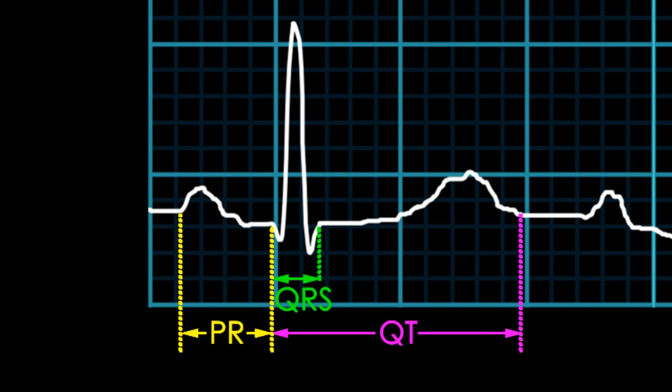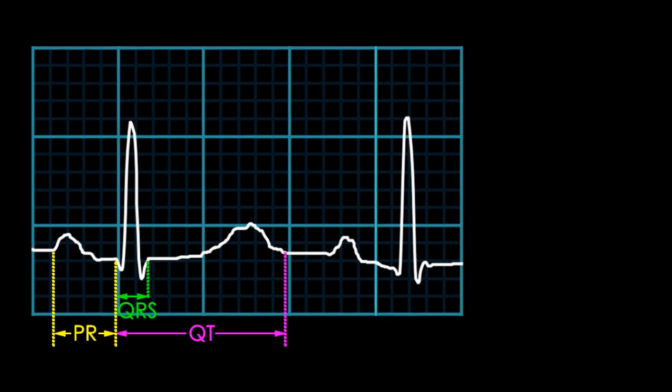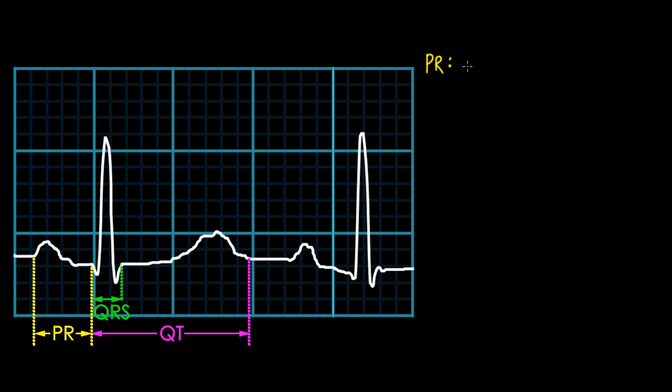Note that it's not necessarily measured to the R wave, but rather to the beginning of the QRS complex. So if the QRS starts with the Q wave, you just measure it to there. A normal PR interval is between 0.12 seconds to 0.20 seconds in duration. In other words, it's between three small boxes in width to five small boxes in width.